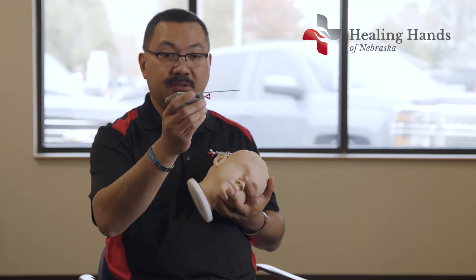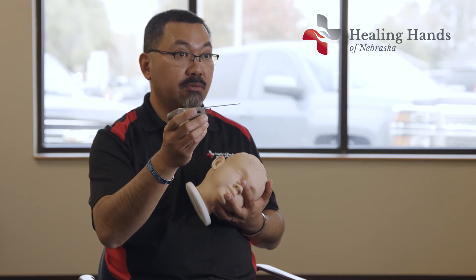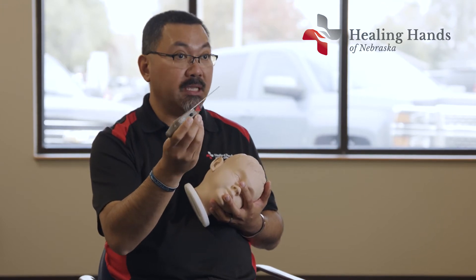The procedure is really simple. This is the device that we use in order to put the tube in. This actually has a tube in it right now.